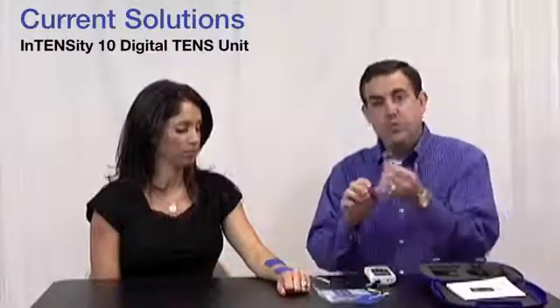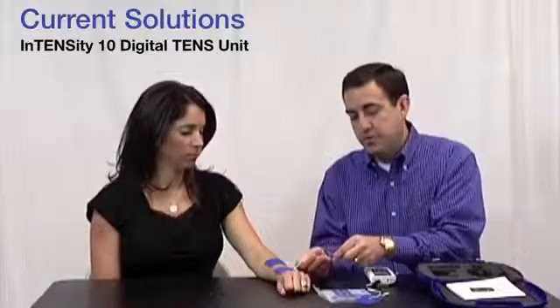What TENS is really used for is this: you're going to feel the electrical stimulation of the TENS lightly instead of the pain in that area. I take two electrodes, I want them to be a couple of inches apart, I plug my lead wires in, and on a two-lead setup like this, it doesn't really matter which is the red or the black.